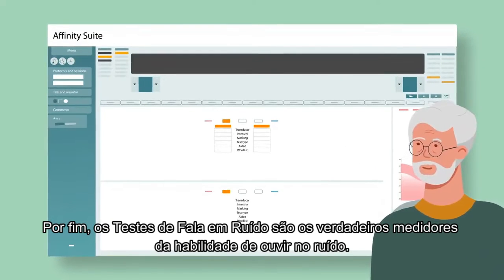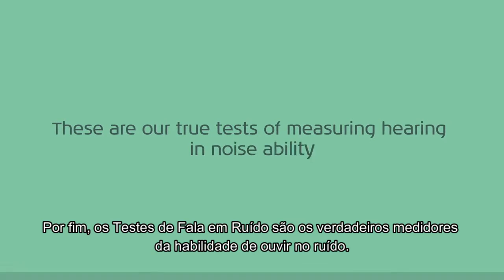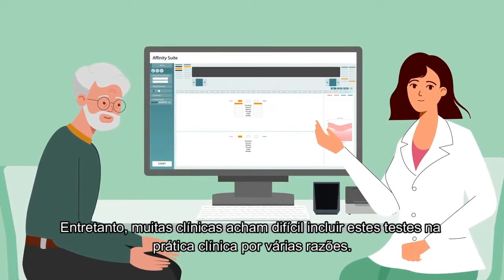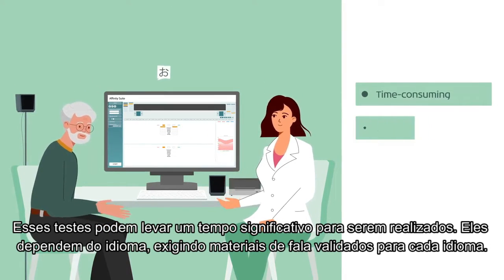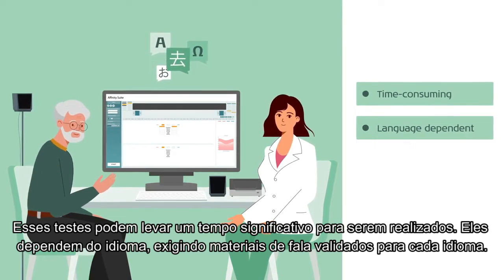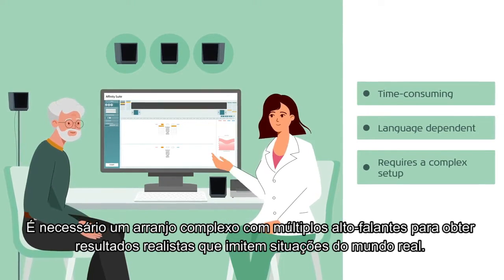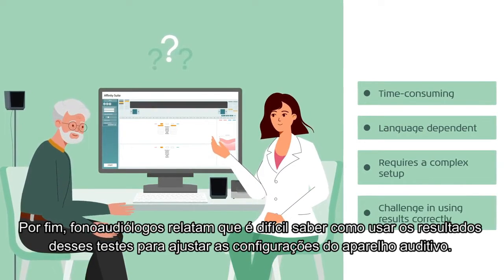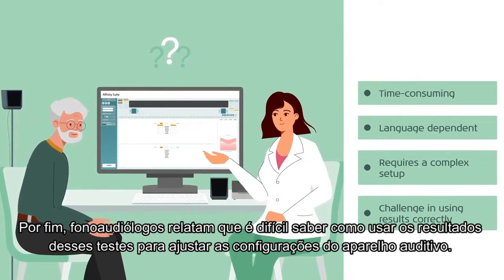Lastly, we have speech in noise tests. These are our true tests of measuring hearing in noise ability. However, these tests can be difficult for clinics to include in their practice for several reasons. They can take a significant amount of time to perform. These tests are language dependent, requiring validated speech materials to be created for every language. A complex, multiple speaker setup is required to produce realistic results mimicking real-world situations. And finally, hearing care professionals report that it is difficult to know how to use the results of these tests to alter the settings in the hearing aid.